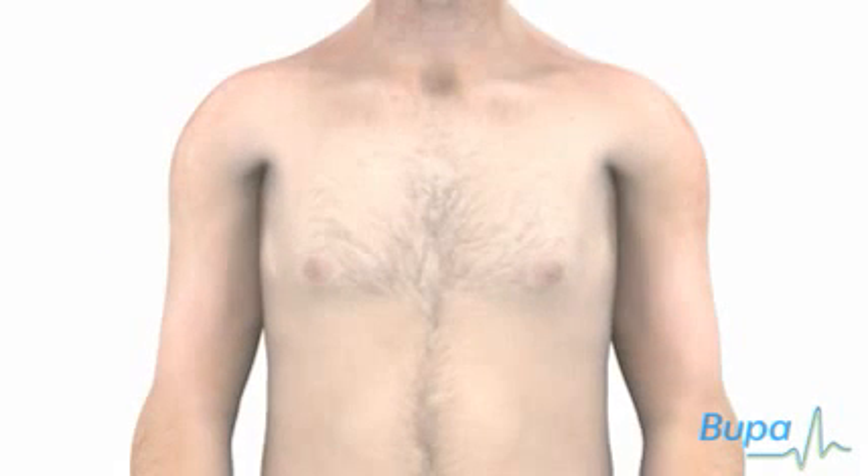This animation will show how a gastroscopy is carried out. A gastroscopy is a test that allows your doctor to look inside your food pipe or esophagus, stomach and the first part of the small bowel or duodenum. Click the navigation arrows below the animation screen to play, pause, rewind or fast forward the animation.